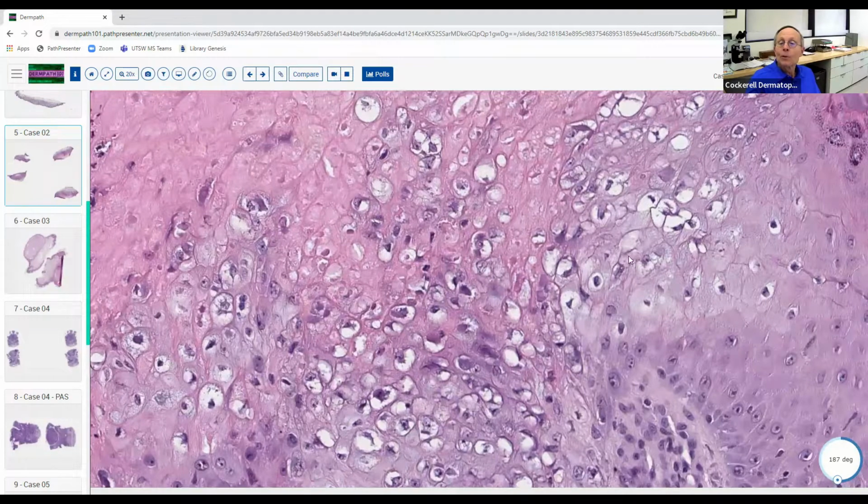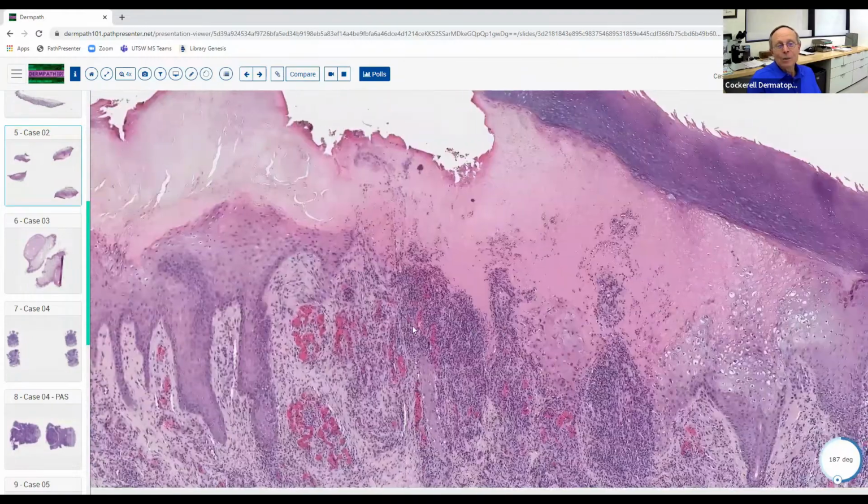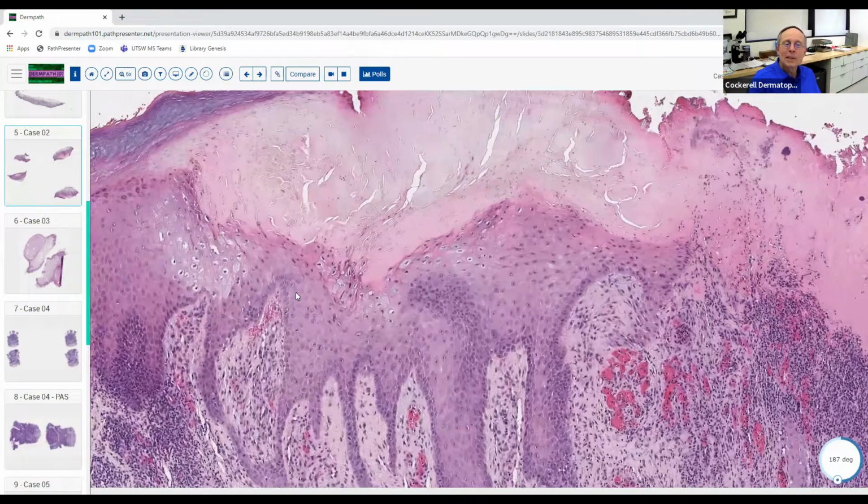That doesn't usually give you the pallor of the cells. It just gives you the inclusions here like this. So these look kind of like molluscum bodies. They're in the same family as molluscum bodies. And if you actually took an electron microscope and zoomed in on these, it would look like little bread loaves inside there. So this was ORF in this case. I don't really think you can reliably tell the difference between ORF and Milker's nodule and any of these things. To me, lump them all together. They all basically look the same.